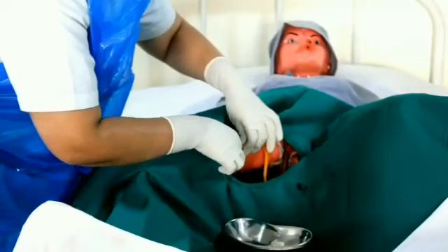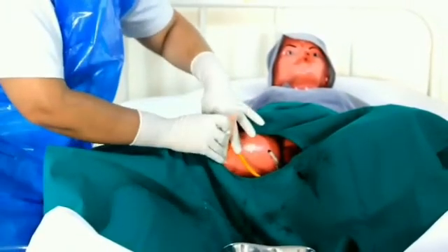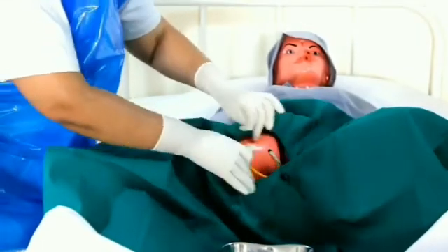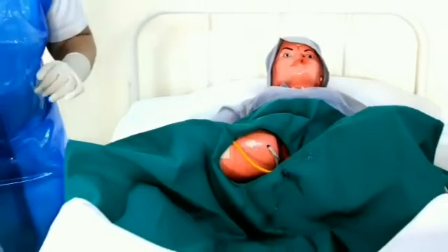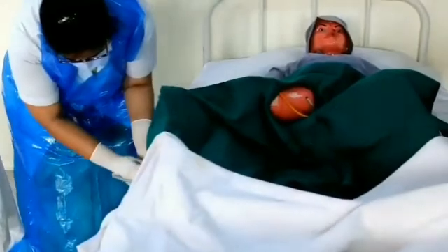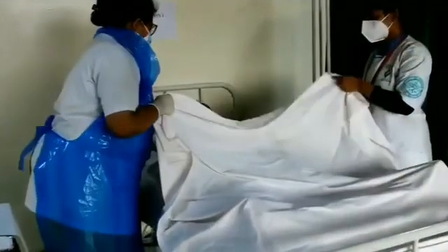Now, we have to attach it to the inner aspect of the thigh with an adhesive tape properly. Take the kidney tray out. Place the urobag below the level of bladder to maintain continuous flow of urine. If necessary, collect the urine sample.